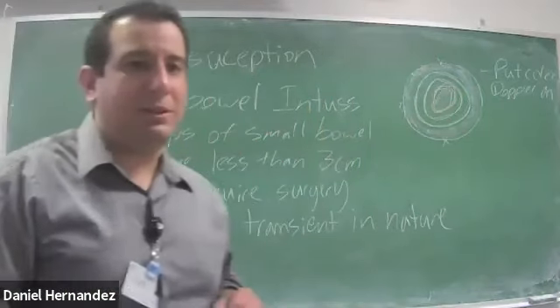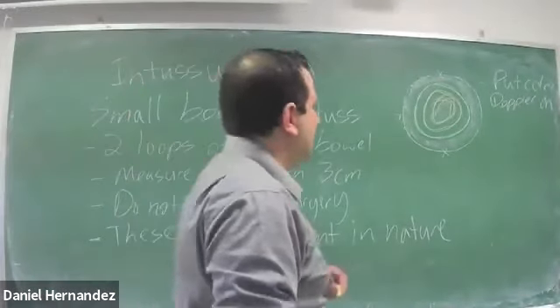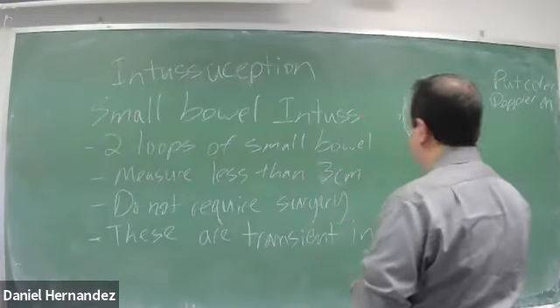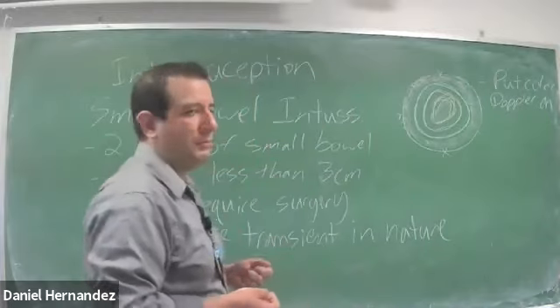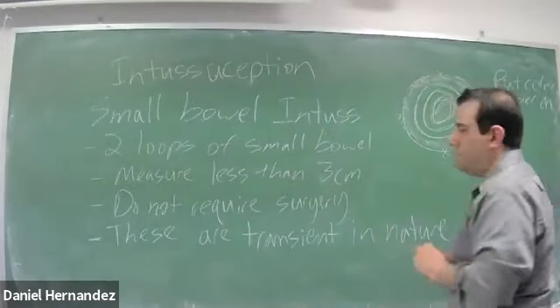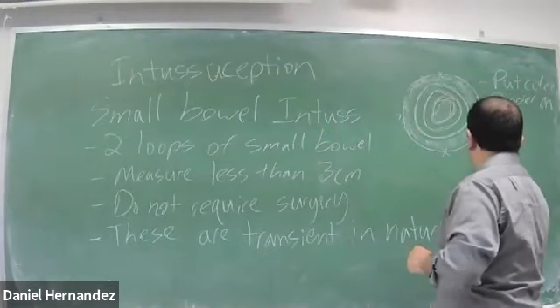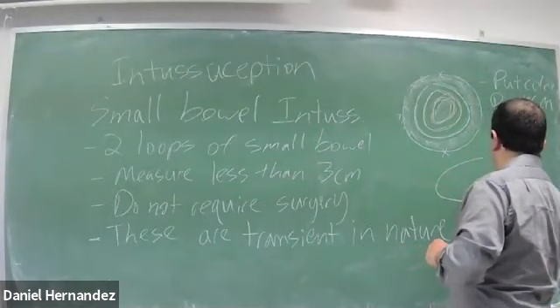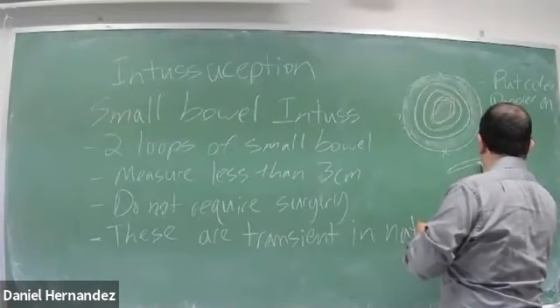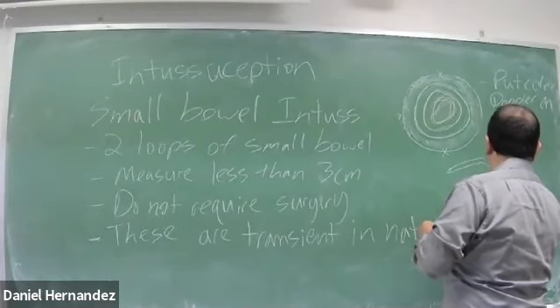You also want to see color because that shows that the bowel is still receiving blood supply and still has some vascularity to it, but you should see rings of color. And then you'll also attempt to get a longitudinal image of your intussusception. You'll want to visualize just how long a segment is involved with the intussusception.